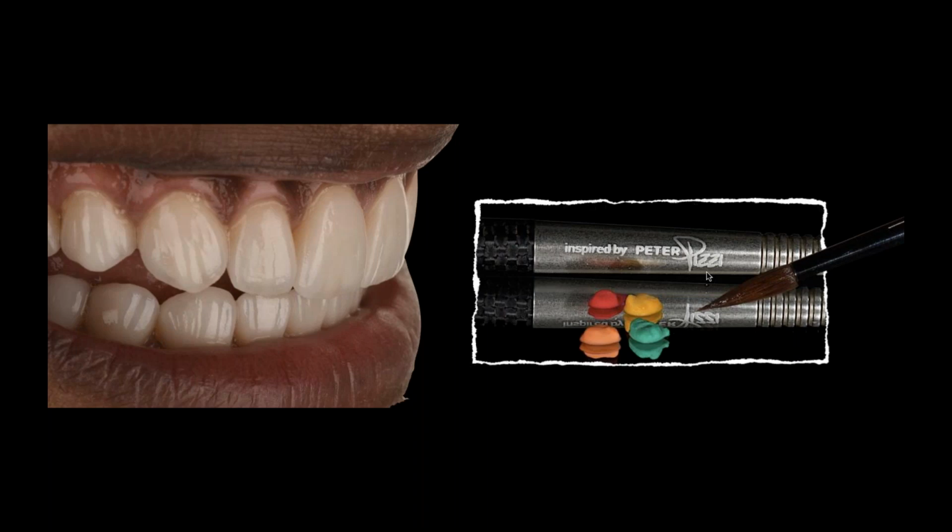When I'm trying to get older looking teeth, like the density one that I showed you earlier in the lecture, I'm using more opacity on the inside and more pure translucent towards the outside. So I want you to see right into that density of the tooth. When I'm trying to build younger, higher value teeth, I'm still using lots of opacity inside, but I'm breaking it down slowly as I get to the outside. So the light has more depth to penetrate into the opacity, and that's how I keep the value up. And then of course, how you polish and luster that tooth at the end will play a huge role in the final. It's a great question, thank you.